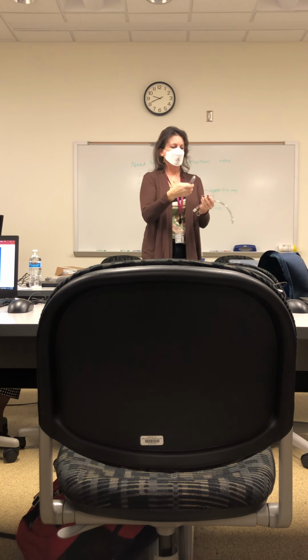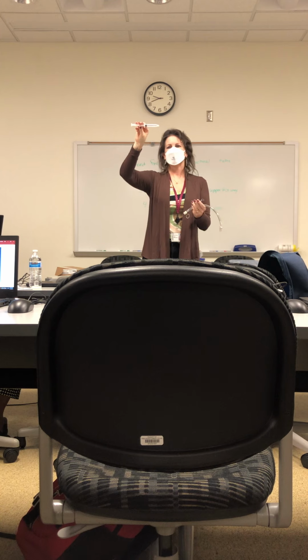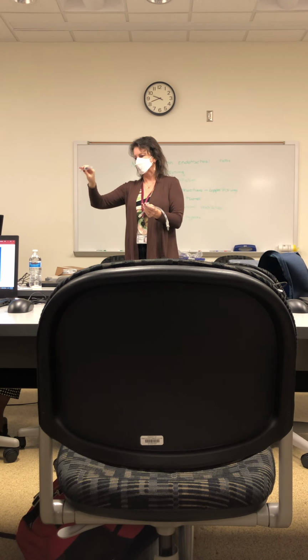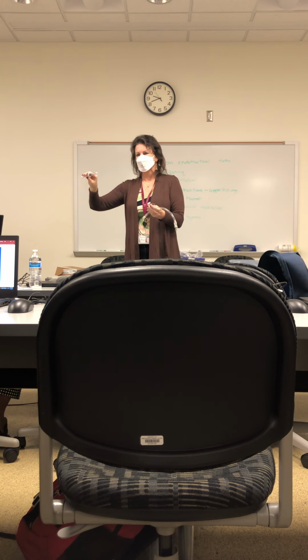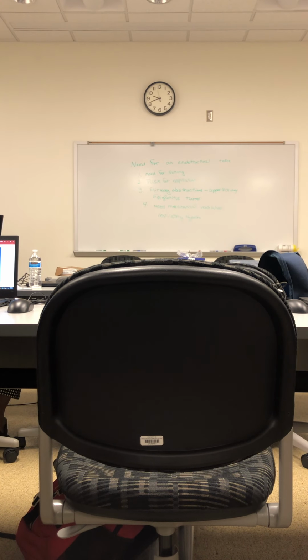So we're going to inflate it with a 10 cc syringe. Preset your syringe to 10 cc's and you're going to inflate it. I got 5. Do I have a 10 over here? I do. We always get a 10 cc syringe because it's easier to work with.